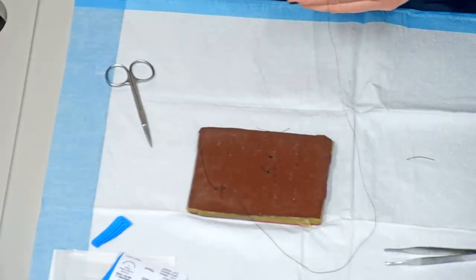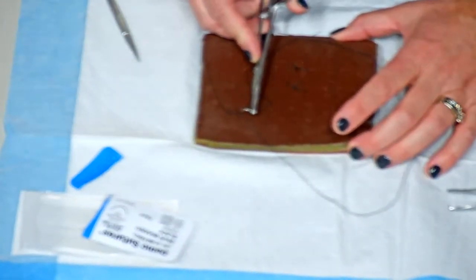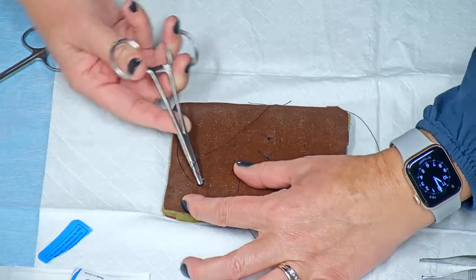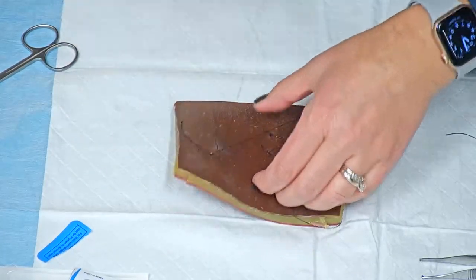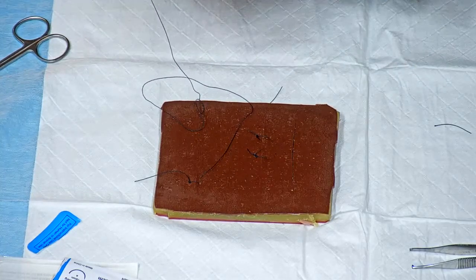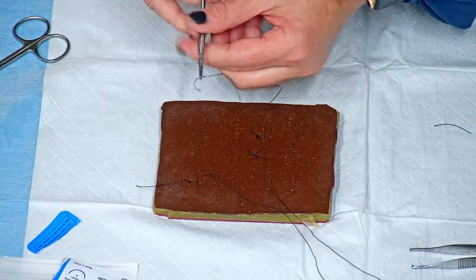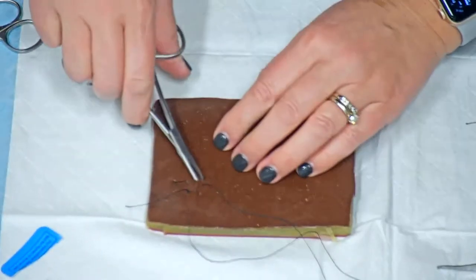So I'm going to reload, and we're going to go right back in where this knot is, and on a 45-degree angle, come up adjacent to this. So we're going to be 5 millimeters down and 5 millimeters lateral to that incision. So we'll go right in where the knot is, 45-degree angle down, come out about 5 millimeters adjacent to the wound. Pull through. We're going to reload. And if you see right now, we're going to come in 5 millimeters adjacent on the right now, and we're going to angle down 45 degrees. Go in, angle 45 degrees down, 5 millimeters below where you came out before. We're going to go ahead and pull that through.